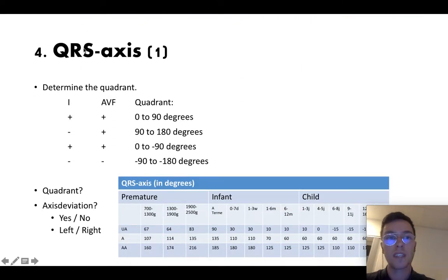Step four, you should look at the QRS axis. So first you need to determine the quadrant. Look in lead I and lead AVF and see if it's positive or negative. And then the combination of those two will tell you the quadrant. So you know which quadrant this is and then you can look in this table. Are you looking to an ECG of an infant or a child?